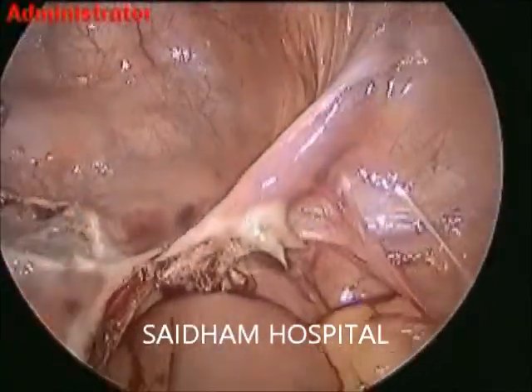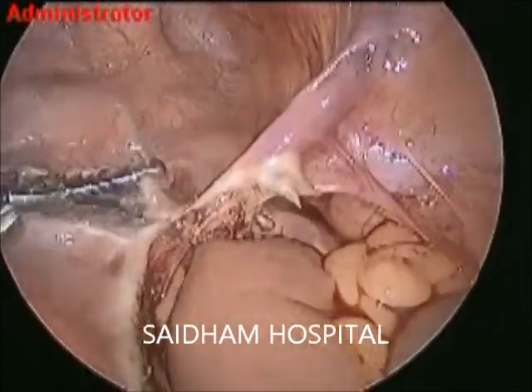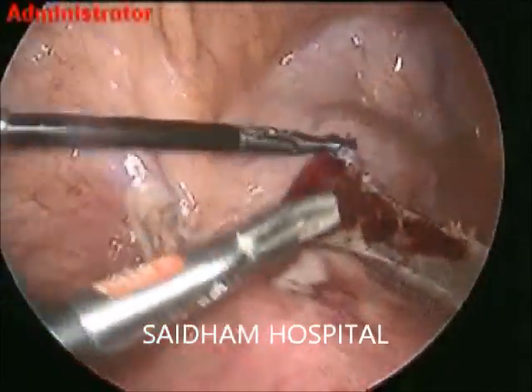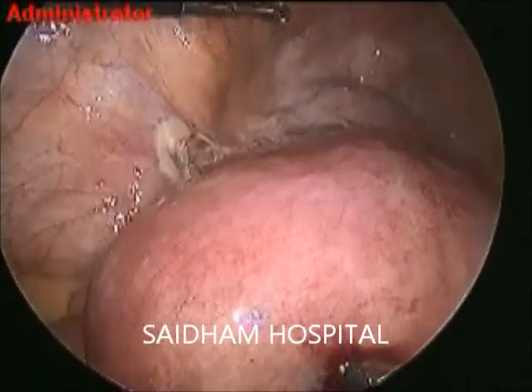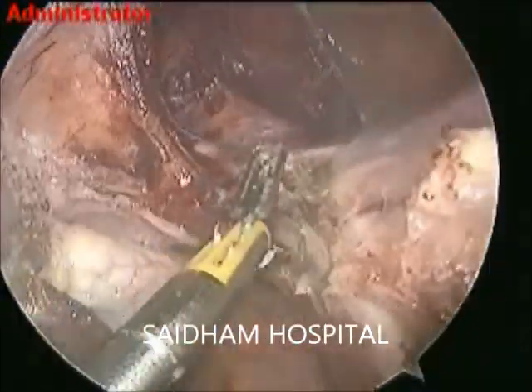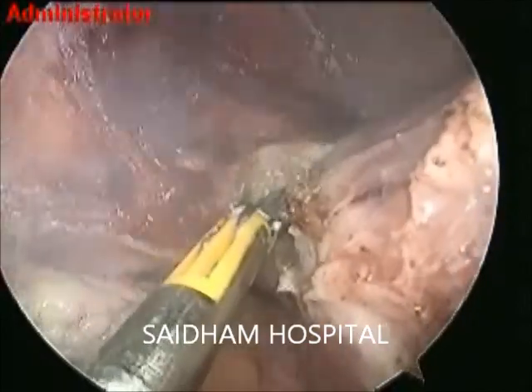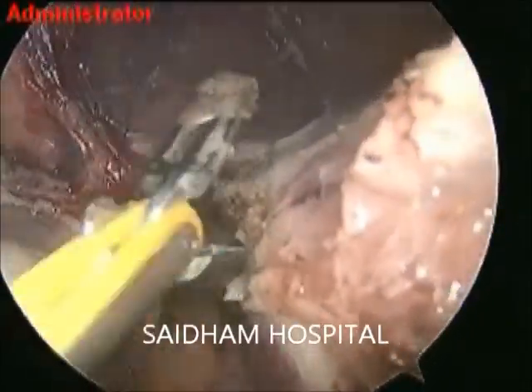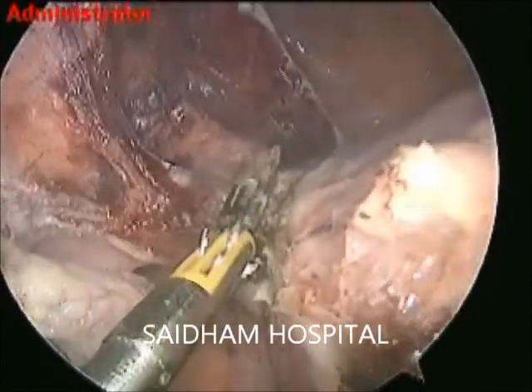I am cutting the UV fold. In grade 4 endometriosis, we may go for retroperitoneal dissection. Cutting just near the round ligament, the right round ligament. Whatever work is done on the right side can be done on the left side. There is a four-port technique — this is called the Saidam technique of TLH, and work is going on from the left side.